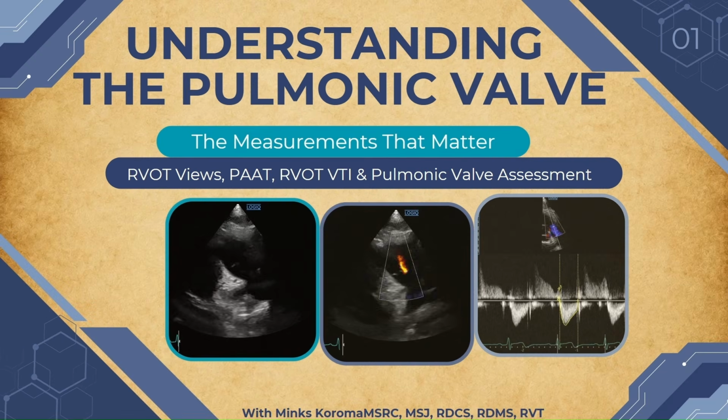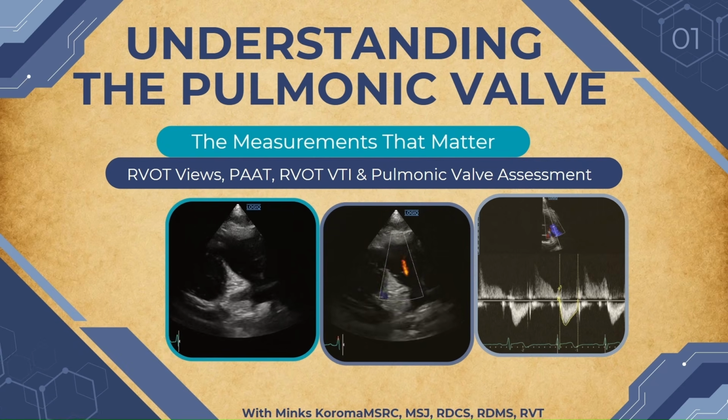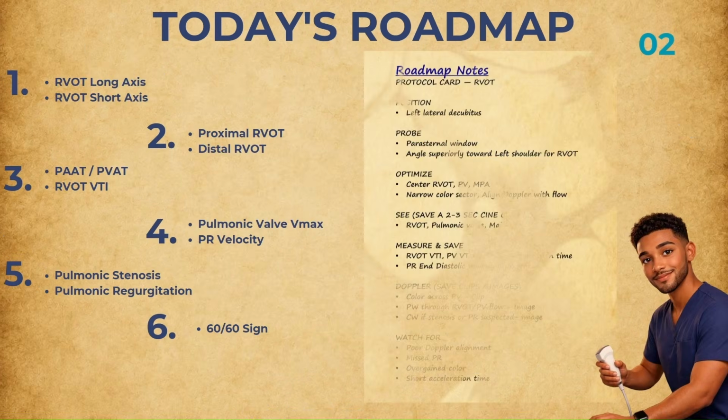Today, I want to show you how I approach the pulmonic valve examination and why some of the most valuable information in echocardiography can come from a single RVOT Doppler tracing.